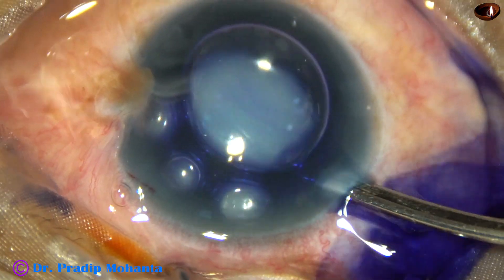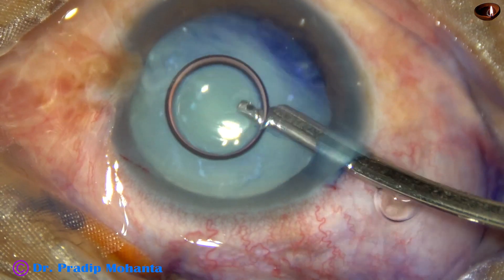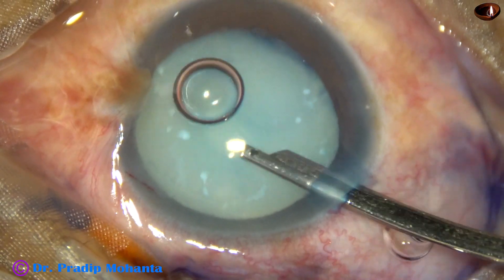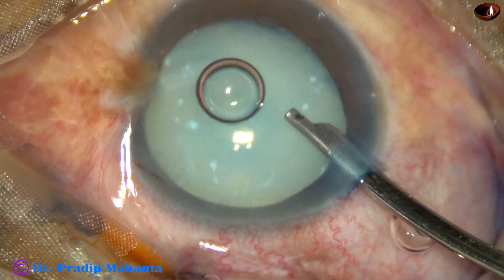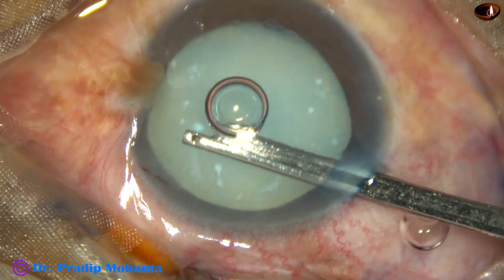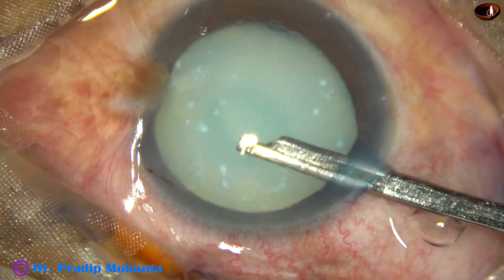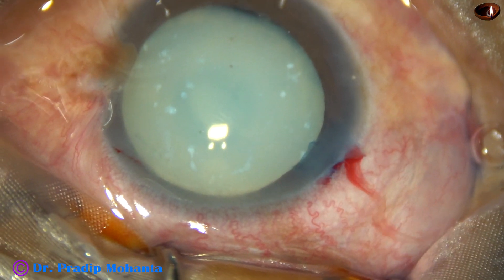The dye is washed out with BSS, and we can see some white specks on the anterior capsule. This is because of degeneration of the lens matter.